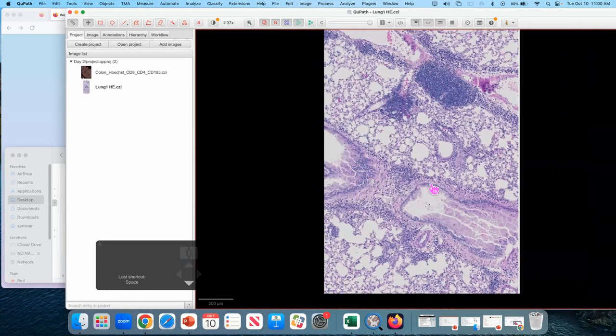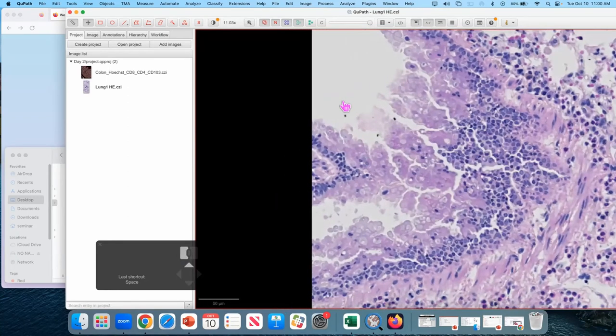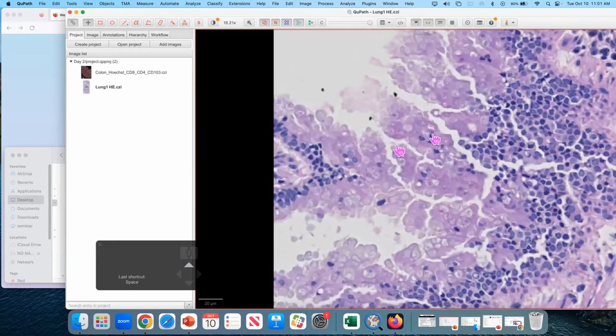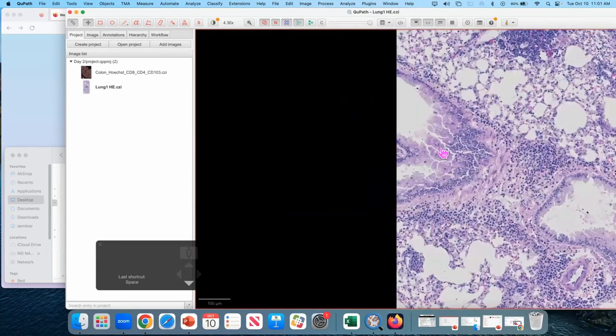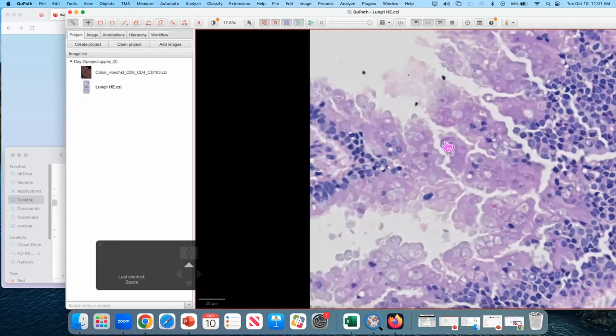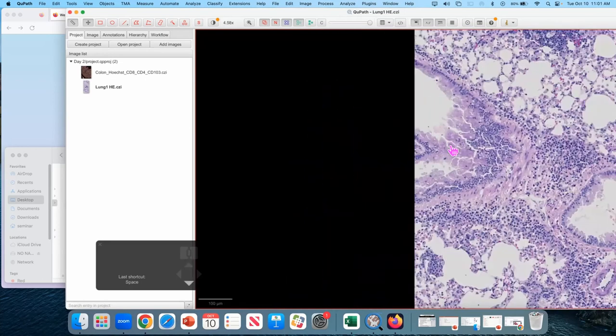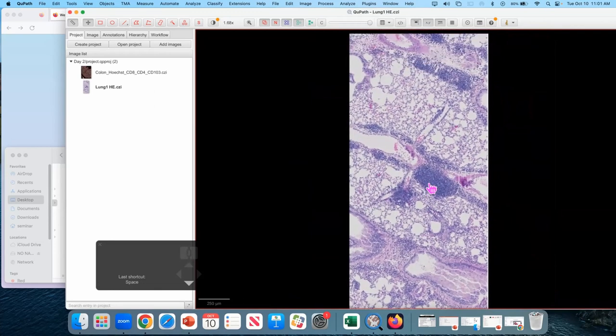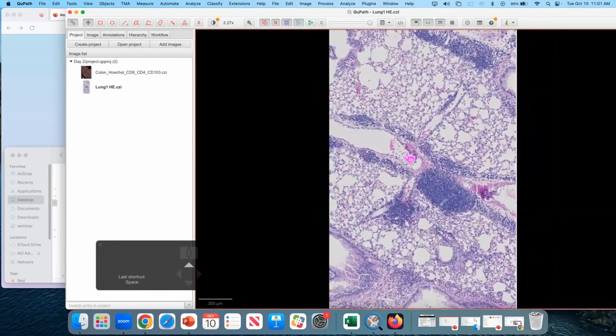I know it's probably a little hard to say, but I would guess that the beginning of this airway is over here. Then as the airway comes over here, it's dipping in and out of section, and then you have a branch point, and we're barely catching the split of the Y of the branch point. And here you have a bunch of epithelial cells that are in tangential section. You have to be very careful interpreting necrosis or degradation of epithelial cells because you don't know the fixation conditions and whatnot. And I see a shadow in my blind spot, so I'm just going to move on.